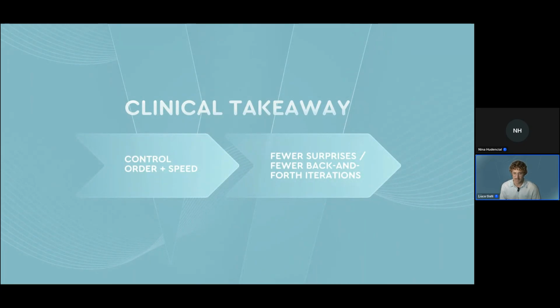From my perspective, in about 90% of the cases, maybe I'll find a few small details I want to tweak, maybe a minor rotation or a contact finishing or a bit of torque. But sending the case for one more iteration just for those tiny details often creates more work and more delay than simply adjusting it myself in a quick, straightforward way.